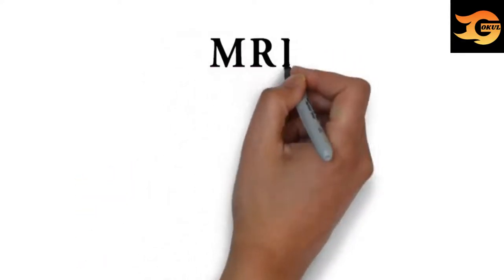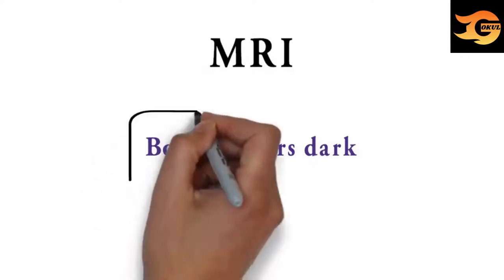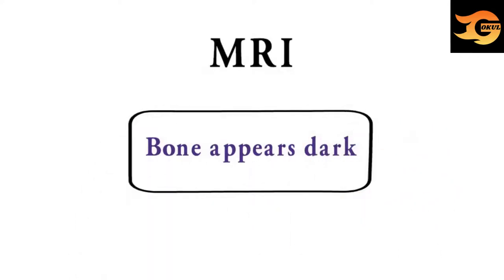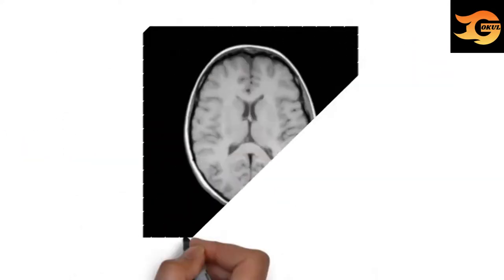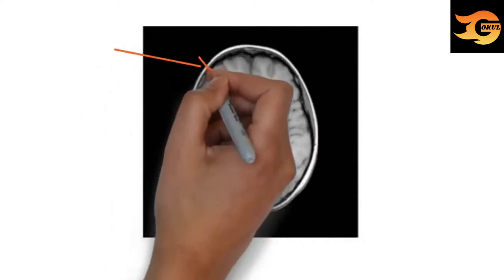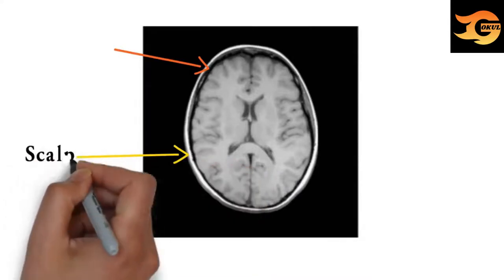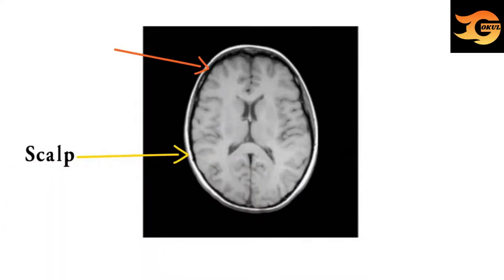Now we will see MRI. In MRI, bone appears dark, and that's the main differentiating point from CT scan. In this picture you can identify it as MRI because skull bone is appearing dark. Don't confuse it with the thin layer of outer scalp fat, which is appearing white.